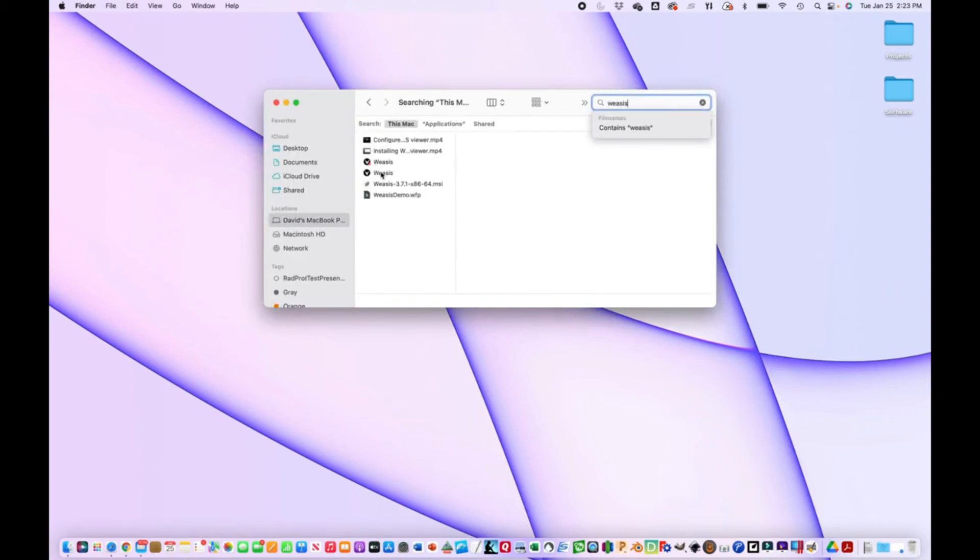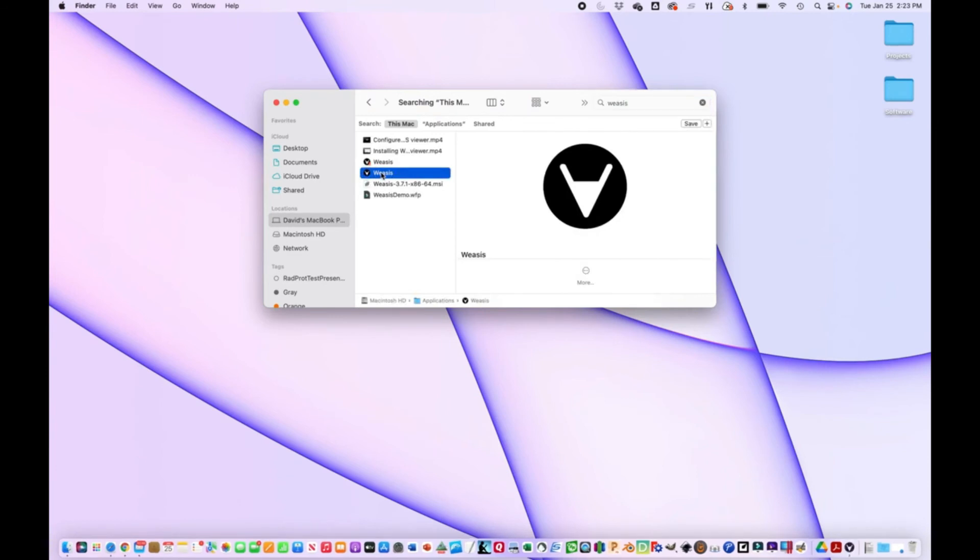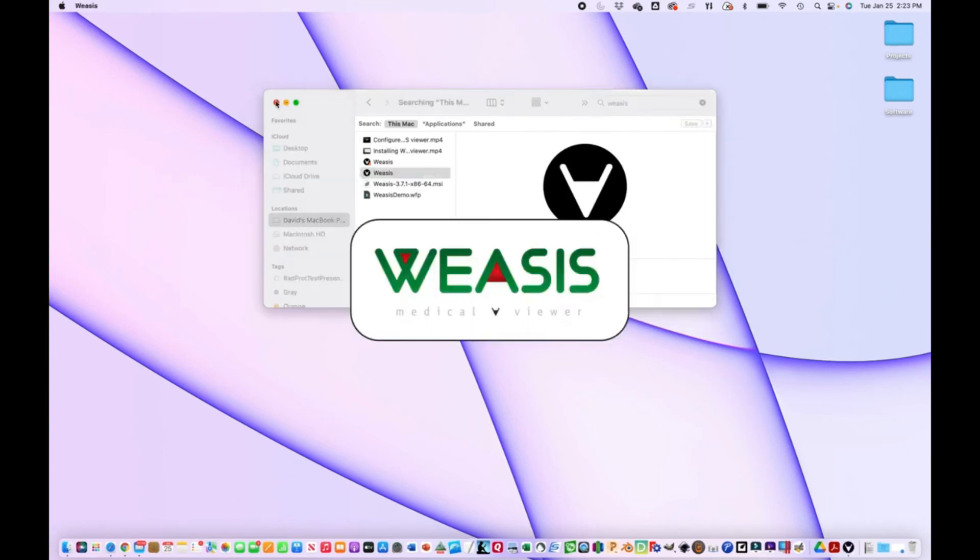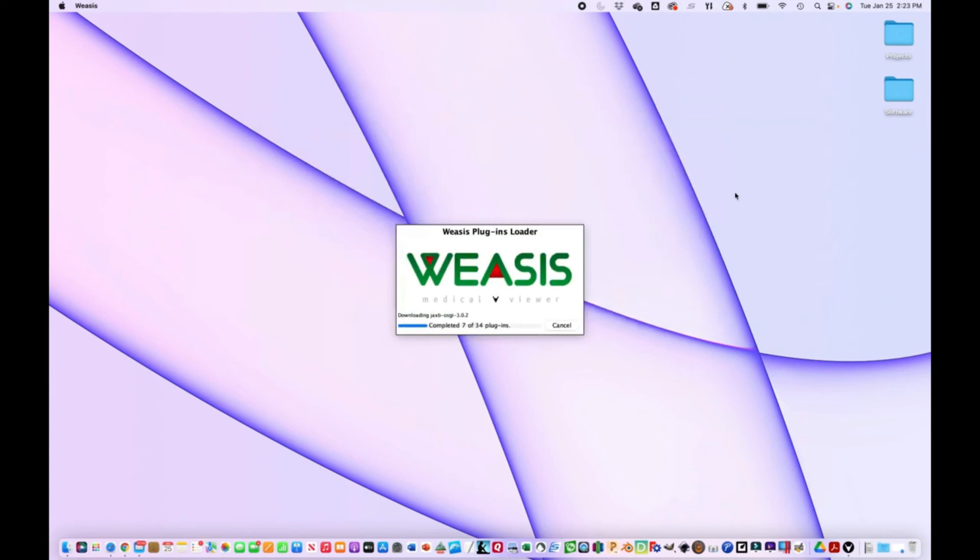Here it is. All right, it's running. How to do it. Thank you.